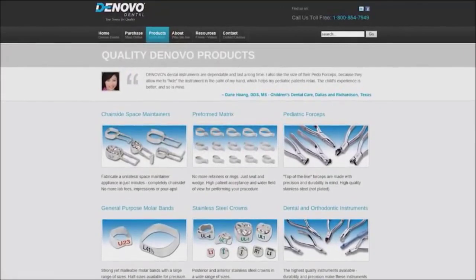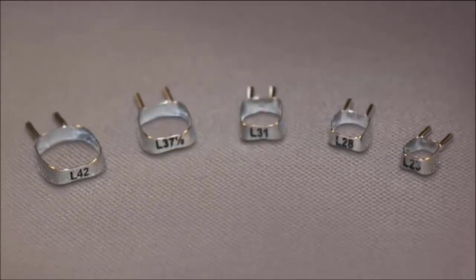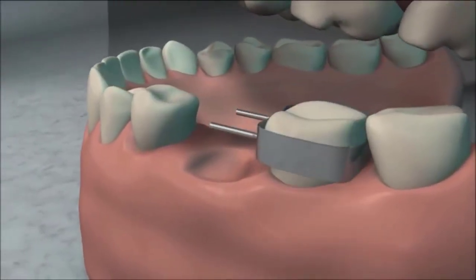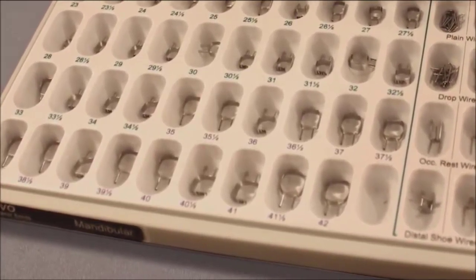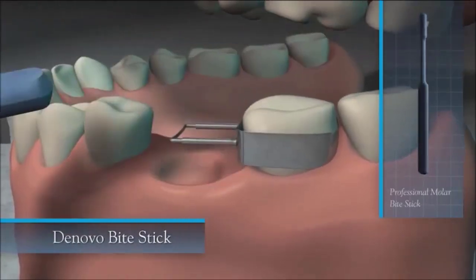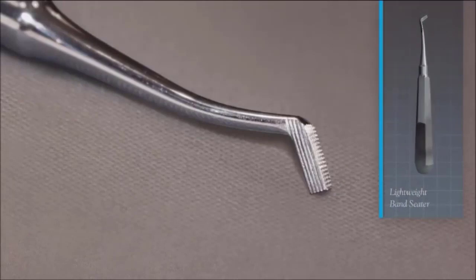Once you've extracted the tooth, determine the correct size band from the chairside maintainer kit for the tooth adjacent to the extracted tooth. Do a trial fitting to confirm the band is snug. The kit comes with a range of sizes accommodating the large majority of cases. Using the De Novo bite stick, have the patient bite down so it pushes down on all four cusps. For additional seating force, use manual pressure with the lightweight De Novo band seater.